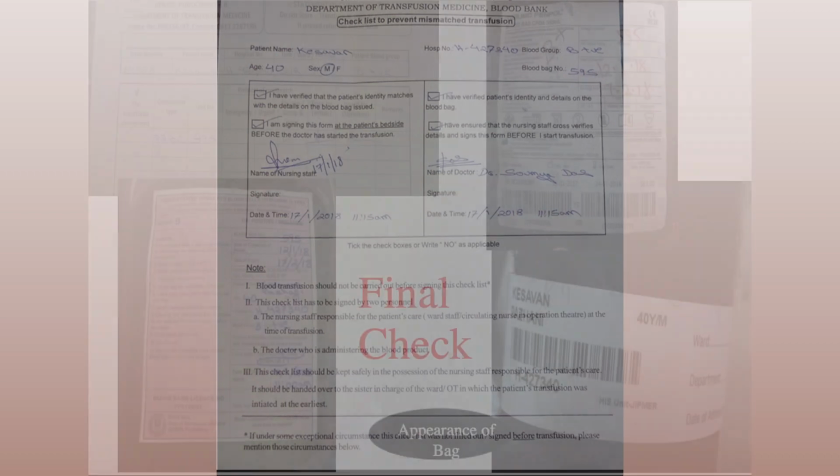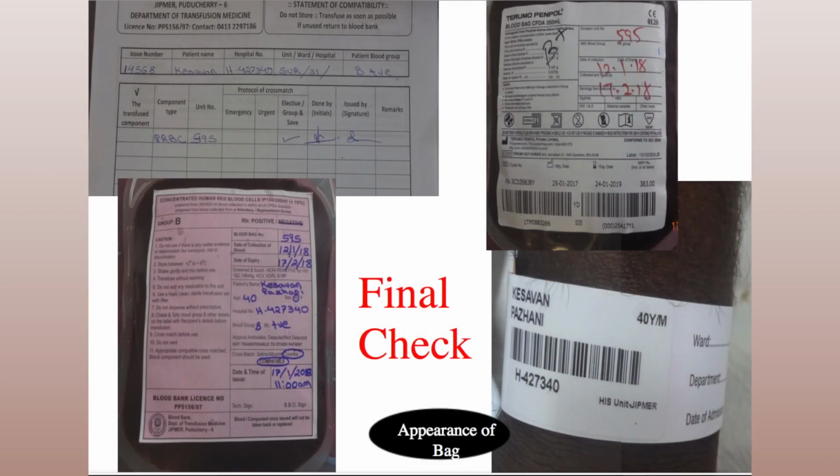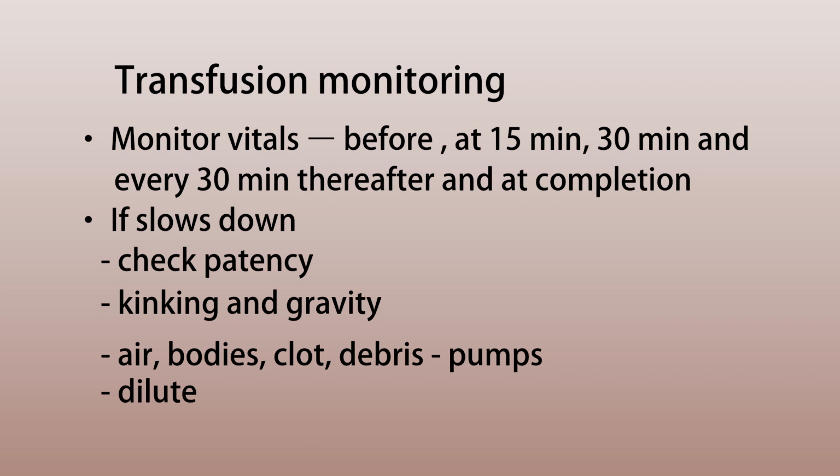And that is the final check. You have to check the blood product there, the barcode or the label of the patient that is written, as well as the cross-match receipt that you have got from the blood bank. So once all this is done, with a patent IV access, you can start the transfusion slowly. Before starting, as I said, you have to monitor or record all the baseline parameters.